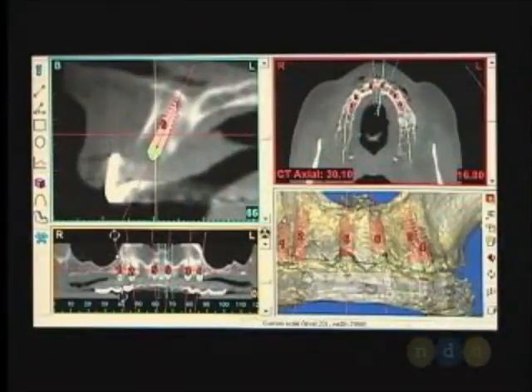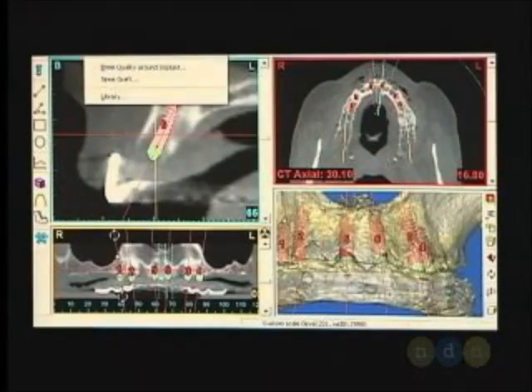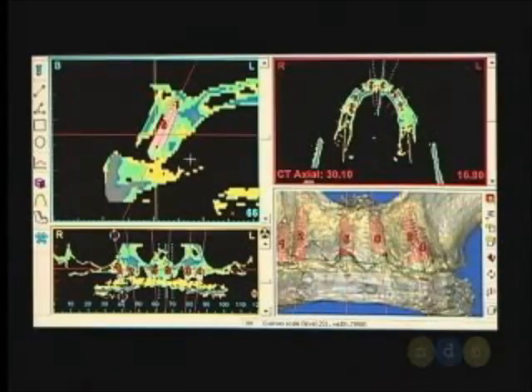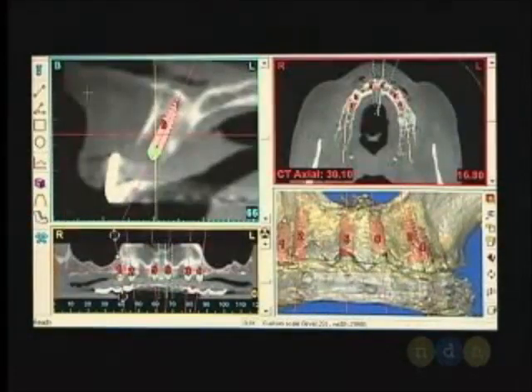In the early 90s, we were able to use CAT scans just to see where the bone was. Today we can not only see where the bone is, we can also test the quality of the bone. Let's take a look at another tool we can use. We can go to bone quality, and this is going to tell us what kind of quality of bone is around you. Just another issue that we can do, another piece of the puzzle that hasn't always been around.